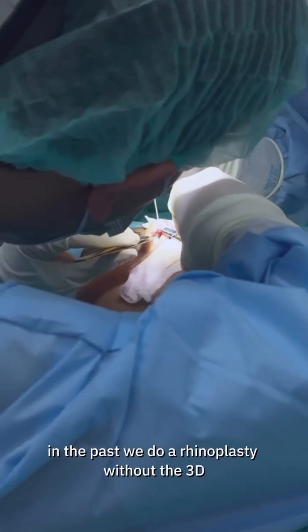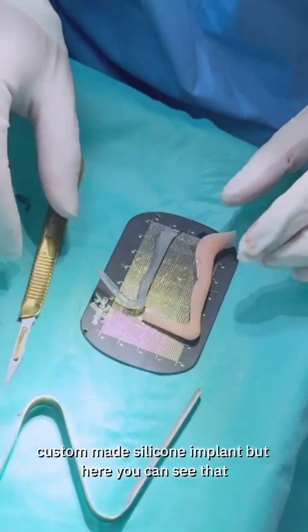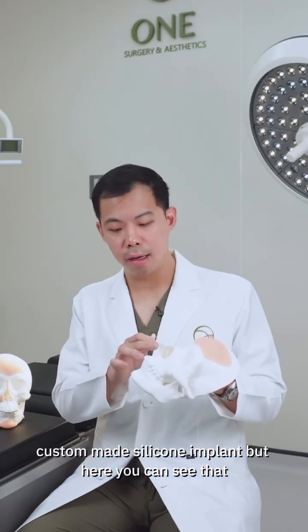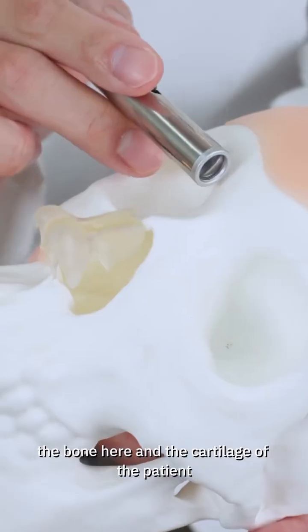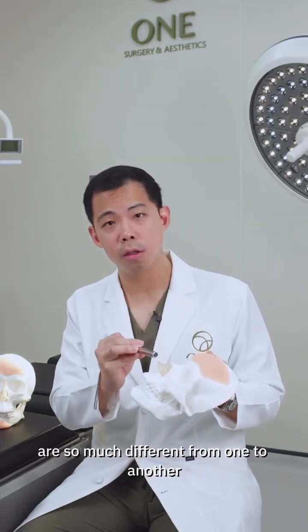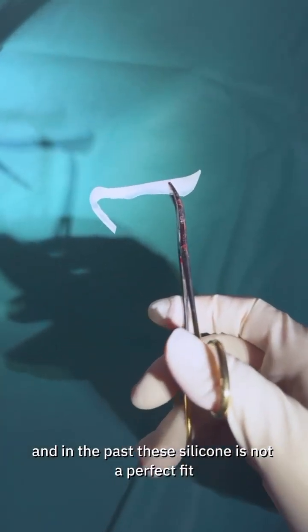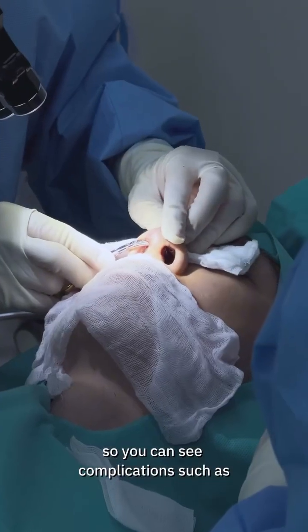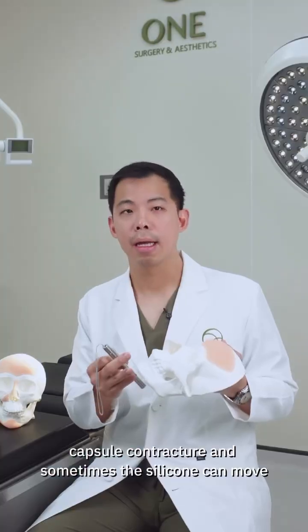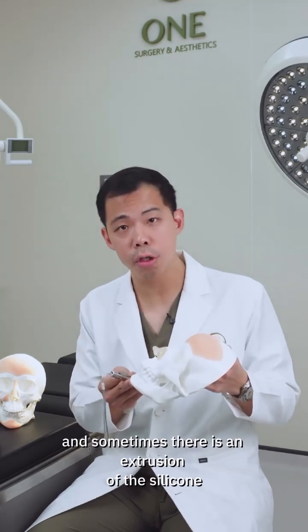In the past, we did a rhinoplasty without the 3D custom-made silicone implant. But here you can see that the bone and the cartilage of the patient are so much different from one to another. And in the past, this silicone was not a perfect fit. So you can see complications such as capsule contracture, and sometimes the silicone can move, and sometimes there is an extrusion of the silicone.